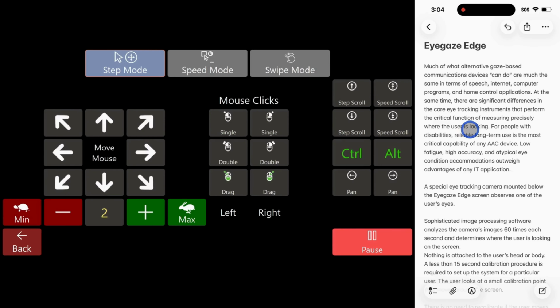So where can drag be more useful than swipe? We will use the Notes app to show how drag can be useful. Let's leave the cursor right on the word reliable. You'll notice the note isn't in edit mode yet. To bring it into edit mode, you'll single-click once and notice the text insertion point blinking in the middle of the word reliable. Now that you are in edit mode, double-click directly on the word reliable.